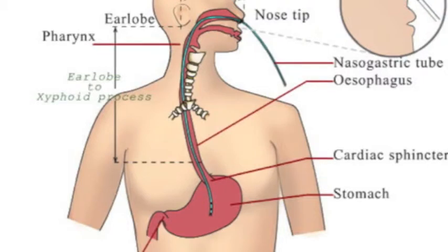You don't do this number, which I've seen done in the hospital setting. What have you just done? You've broken the action of this air vent. This acts as an anti-reflux, meaning whatever is in the stomach is coming out through this lumen, going through here.